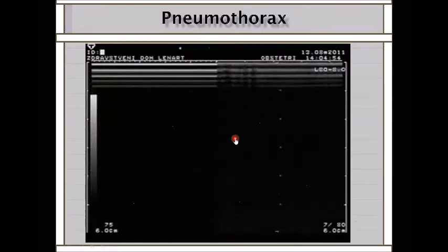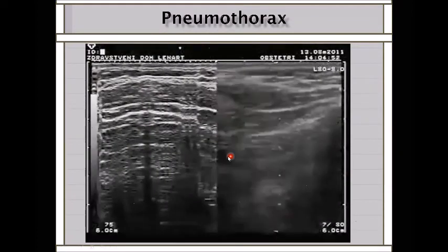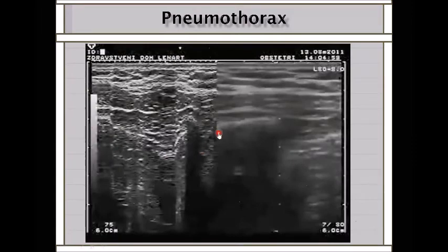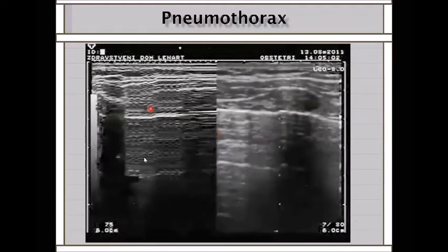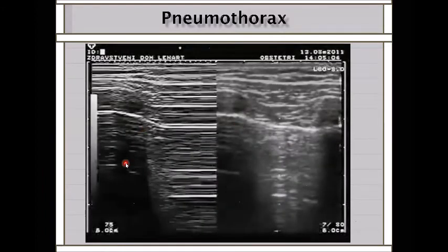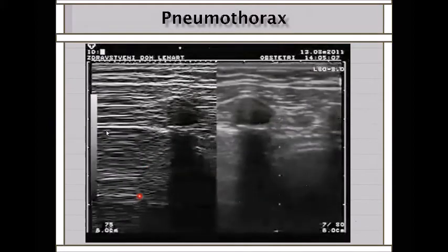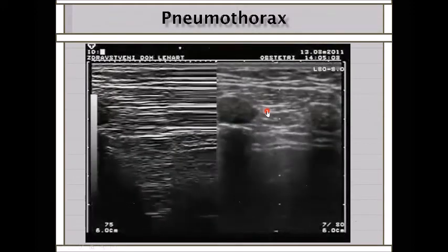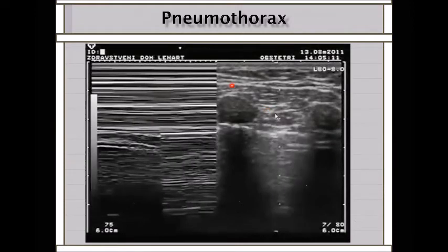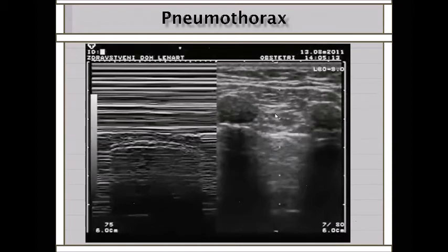Here are examples: sand present equals normal lung, barcode sign equals pneumothorax. You can clearly see the alternating pattern—sand here, barcode there, sand here, barcode sign. At the lung point you can see barcode on one side and normal sand on the other, because you are at exactly the boundary between pneumothorax and non-pneumothorax.